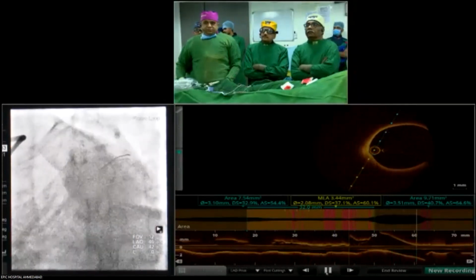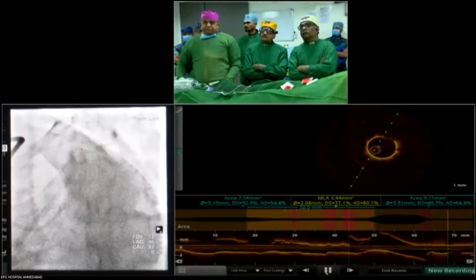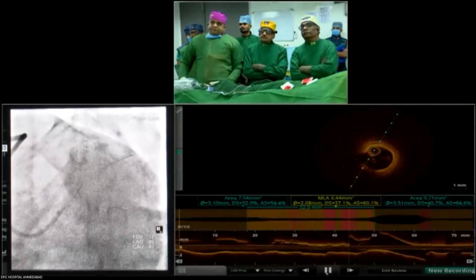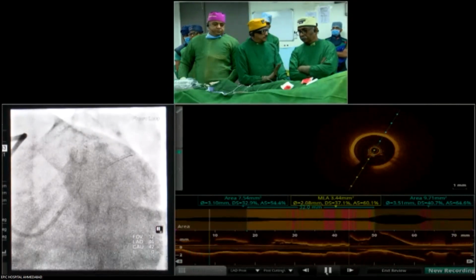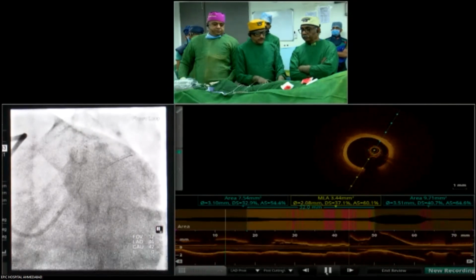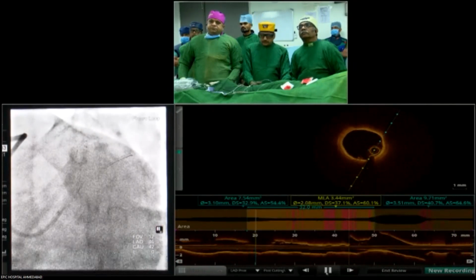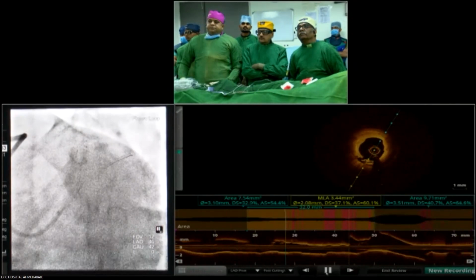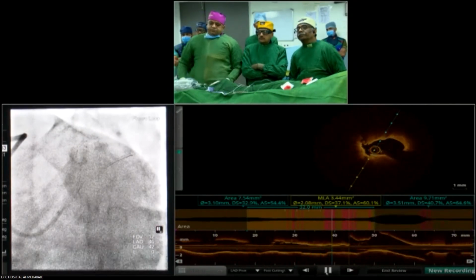Today morning we saw that. But even then, just putting a balloon alone cannot do. You can dilate with a low atmosphere, 4 or 5 atmosphere pressure and keep it. That's one way. Number 2, earlier people were doing the Szabo technique, where keeping a wire into the circumflex also works out. And many a time, if you use newer machines with clear stent imaging, you inject contrast and place the stent there, then inject and take imaging. You can clearly see the contrast going and you can accurately place the stent at the ostium of the LAD. Clear stenting also helps.